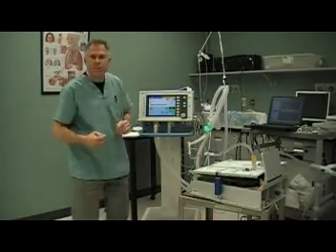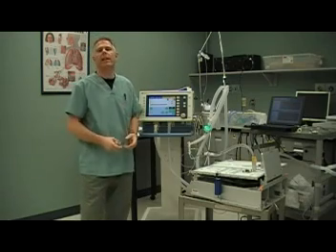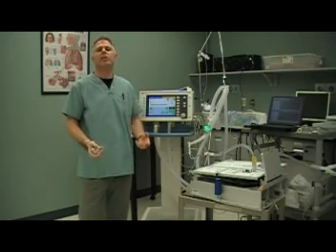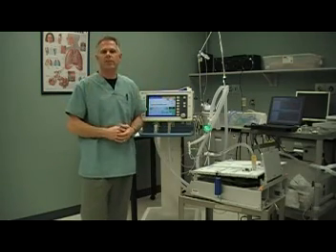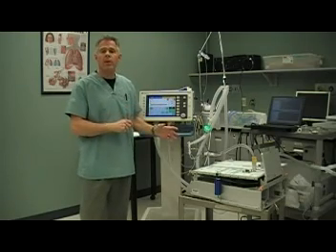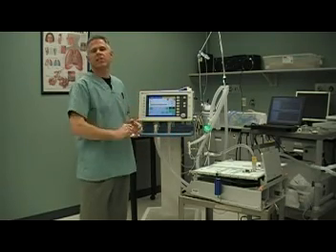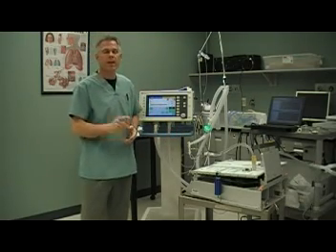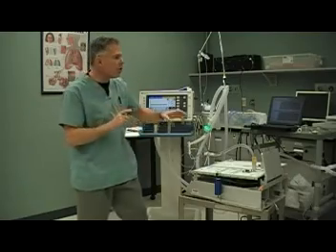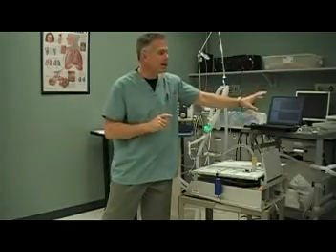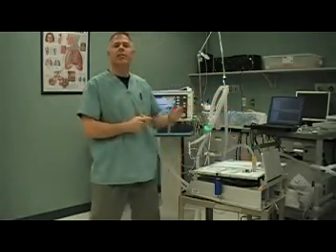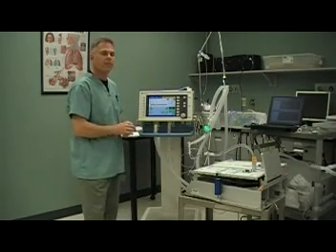The concept behind pressure support ventilation is to augment the patient's own inspiratory efforts. If the patient's not breathing, the ventilator will not assist. To demonstrate this mode, I have one ventilator over here pretending to be the patient triggering the test lung, as I often do with my fingers.